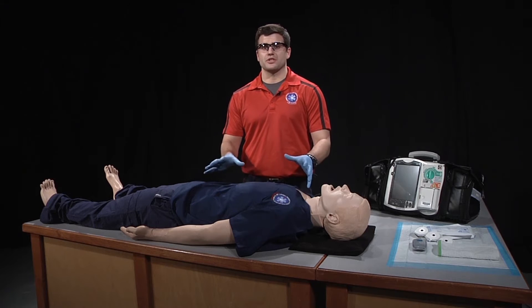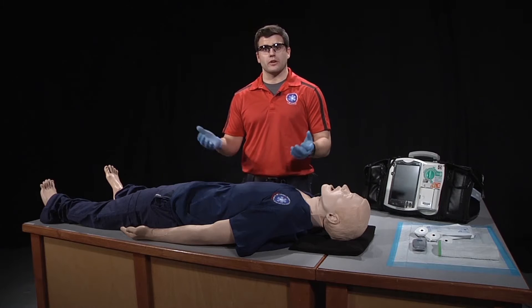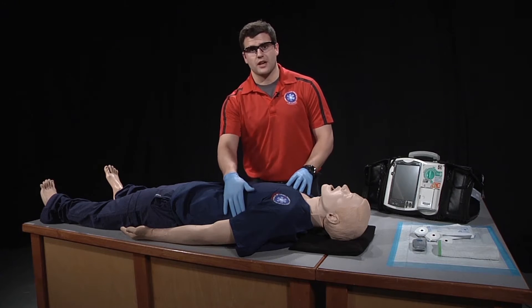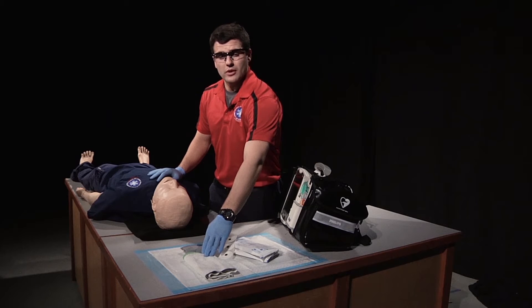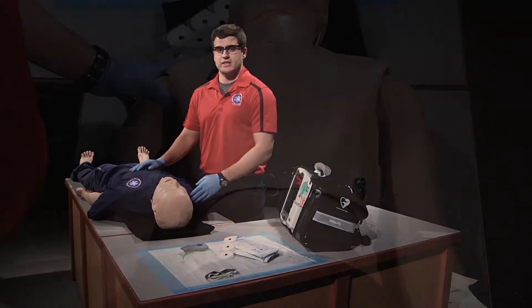The first thing we want to do is explain the procedure to our patient. We want to let them know that we'll be placing electrodes on their limbs, as well as removing their shirt and placing electrodes down the left side of their heart. The equipment we'll need is our cardiac monitor, our electrodes, a towel to wipe away perspiration as necessary, and a razor to remove excess hair from the chest as needed.